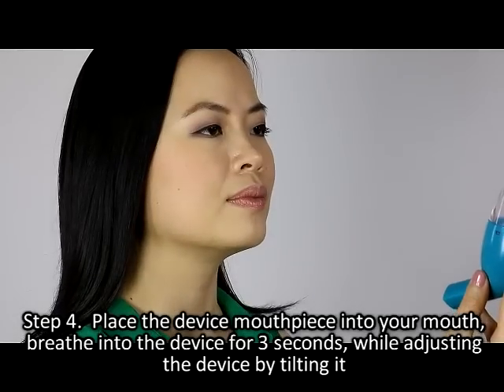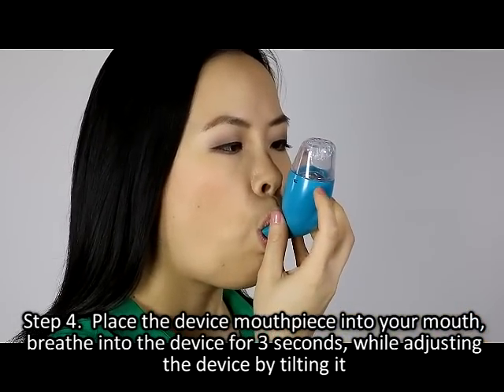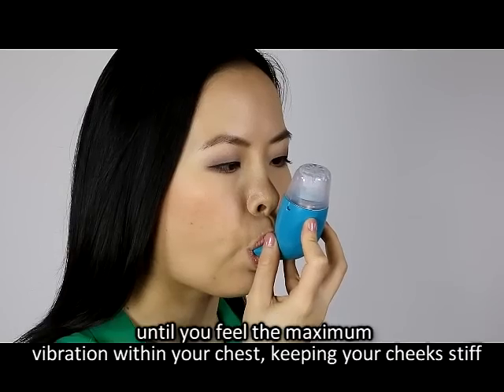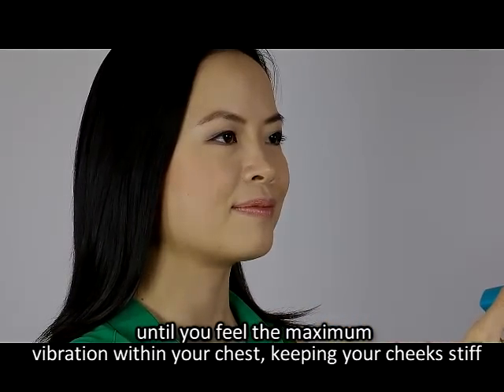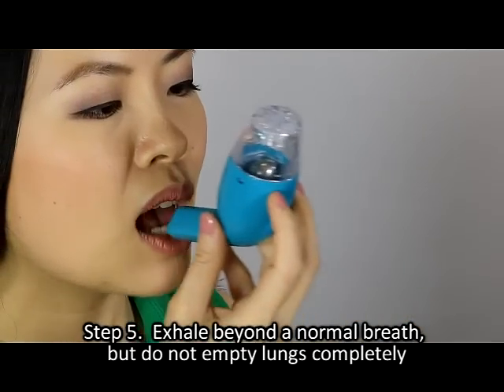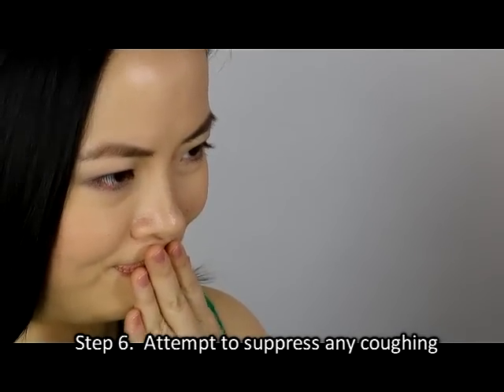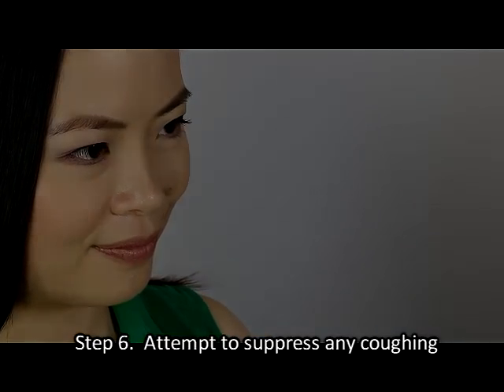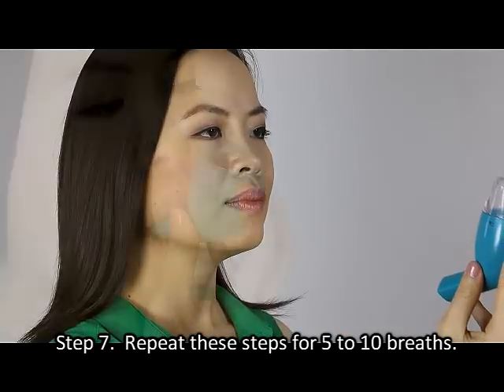Step 4: Place the device mouthpiece into your mouth and breathe into the device for 3 seconds, while adjusting the device by tilting it until you feel the maximum vibration within your chest, keeping your cheeks stiff. Step 5: Exhale beyond a normal breath but do not empty your lungs completely. Step 6: Attempt to suppress any coughing. Step 7: Repeat these steps for 5 to 10 breaths.